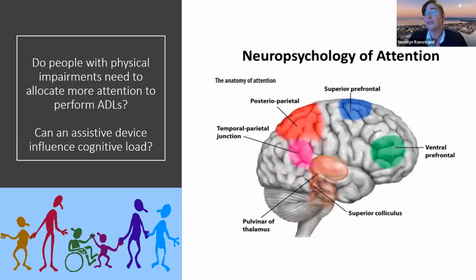In the clinical setting, people will often use a dual task paradigm, and many of you may be using that clinically. When you're doing a dynamic alignment of a prosthesis, you can ask your patient to walk on a level surface without any hazards. Then you can give them a secondary task, a dual task. Count backwards in threes from 170 while you're walking and see what happens, because then you're increasing the attentional demand of the task.